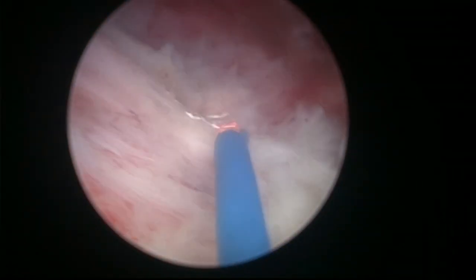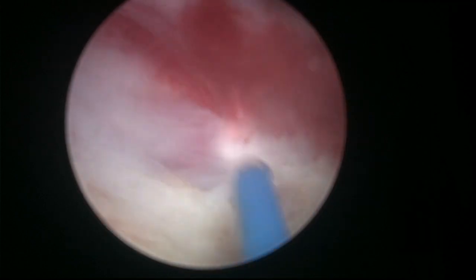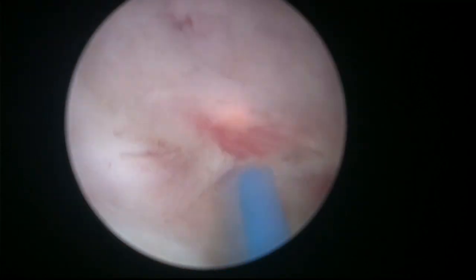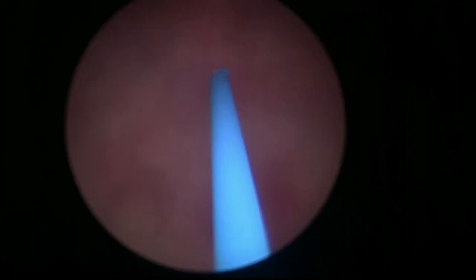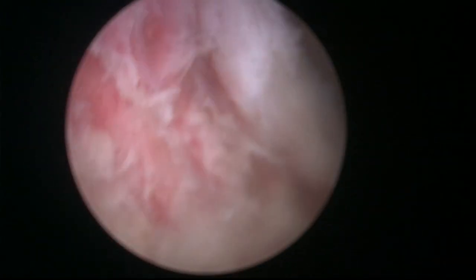You can discuss whether a one lobe, two lobe or three lobe technique is good or not, but my personal view is that this is possibly superior to all those techniques, in the sense that the rationale is solid and the results are solid as well. And I'm trying to showcase this in the videos. The apical dissection can be tricky sometimes, but systematically we can get a very good clinical result, a very good clearance of the adenoma, good hemostasis, good view, fast operations, and fast recoveries of the patients.